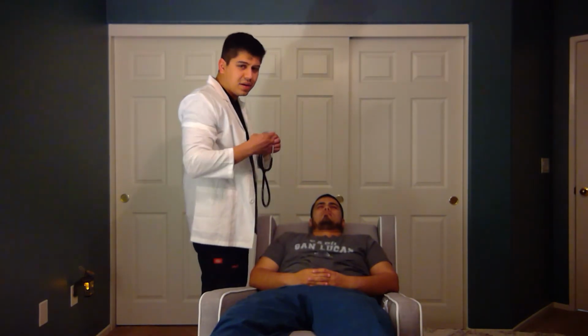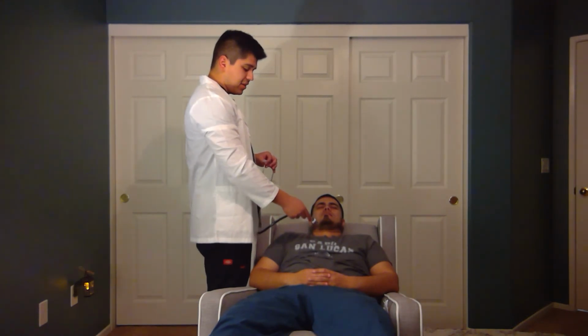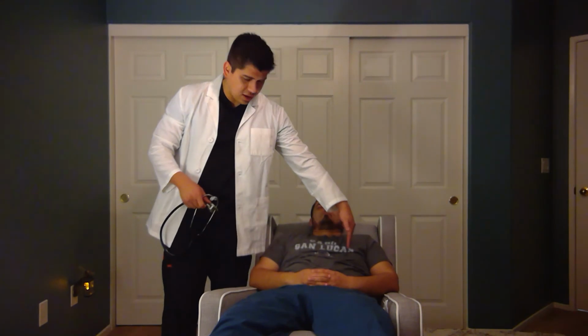The areas that you're going to be auscultating are the second intercostal space to the right, which is the aortic, and the second intercostal space to the left of the sternum, which is the pulmonic. Then down the left sternal border, third, fourth, and fifth intercostal space and Erb's point, and then you go to the left, the midclavicular line, to the apical pulse, the point of maximal impulse.